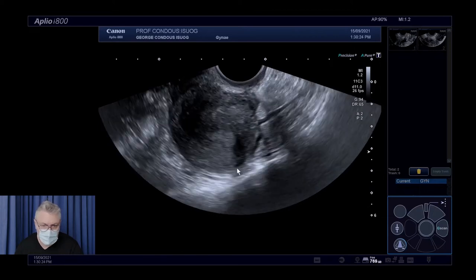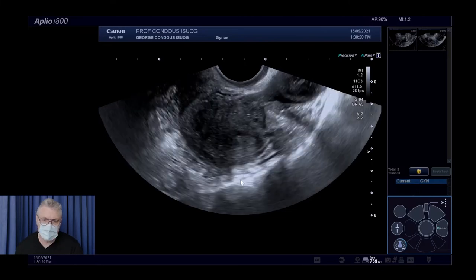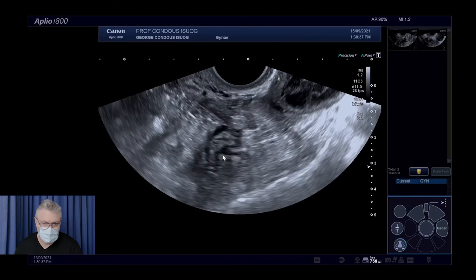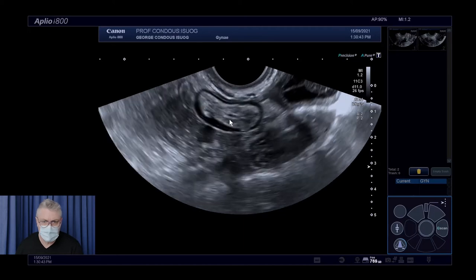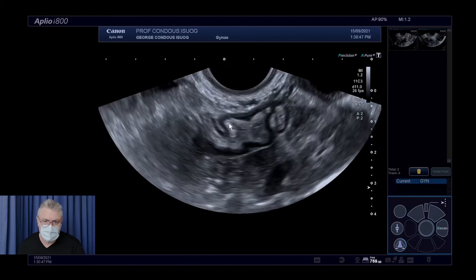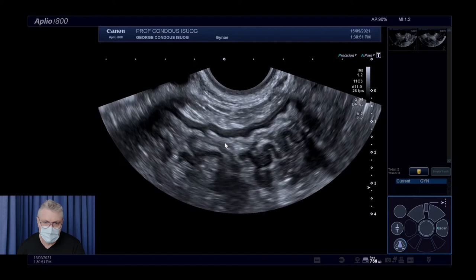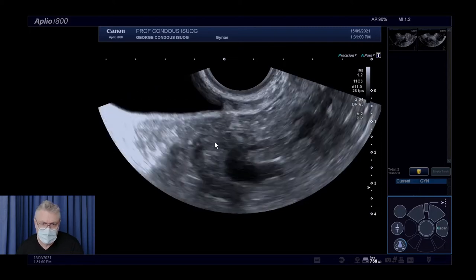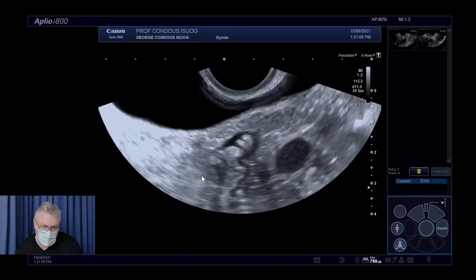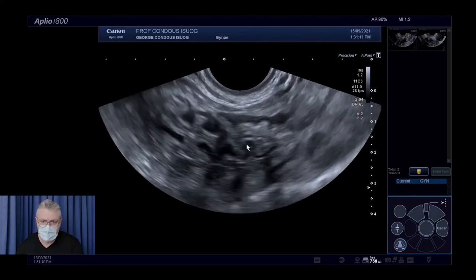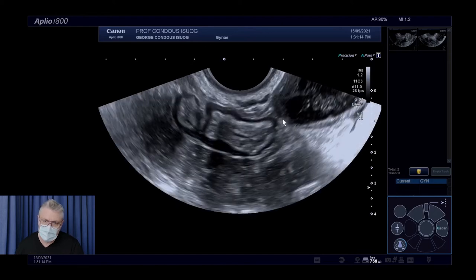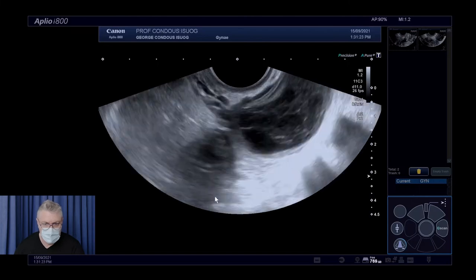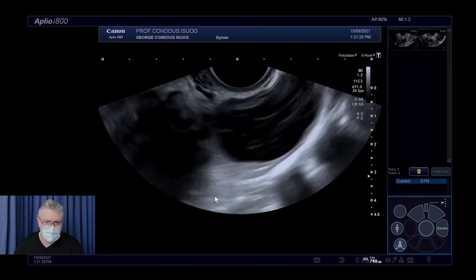We can see the rectal wall wrapping around probably the fundus of the uterus — I think it's a retroverted uterus, which we'll confirm later. Contrary to popular belief, patients don't get bowel prepped and you don't need to bowel prep these patients — you can still get such great views. We can see past the recto-sigmoid junction and into the sigmoid, which rests up against the bladder and heads cephalically. Following the anterior muscularis back caudally, I think it's a unifocal rectal lesion.